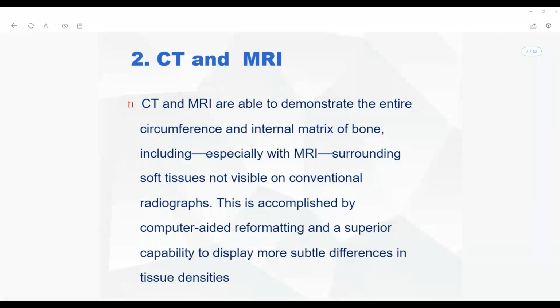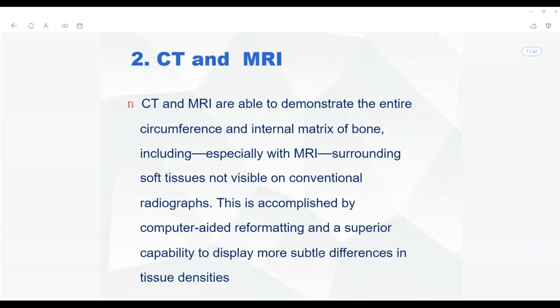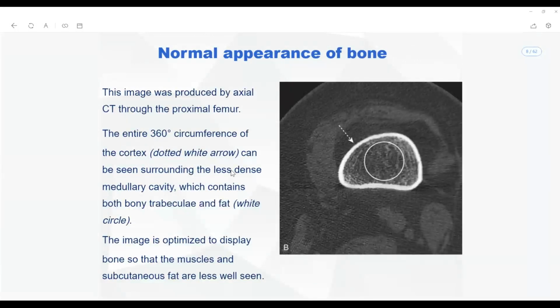So I'm going to look for the clinical condition called compartment syndrome. I'm also going to evaluate for ischemia, and for structural integrity. All of those things will be done on MRI and CT scan. So that's what I preferred as investigations for these patients, the four patients I have been talking about. All of them will form different densities.